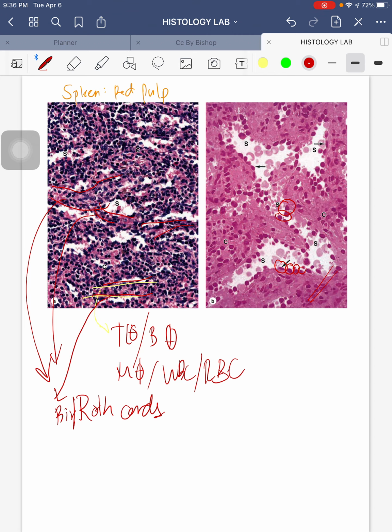Stave cells are endothelial cells that line your splenic sinusoids. What do they function for? They allow separation of healthy RBCs from defective or old RBCs. The healthy RBCs and other cells like platelets and white blood cells can diapedese, or pass through.